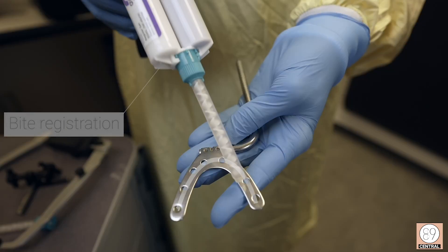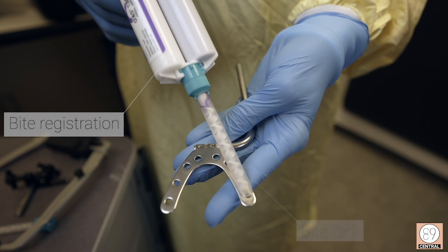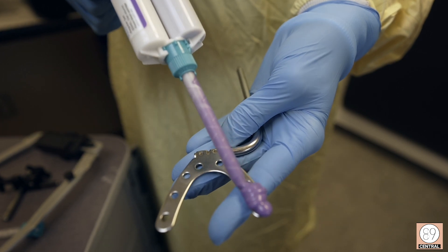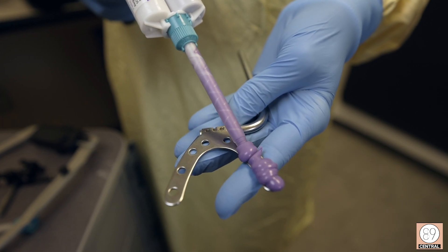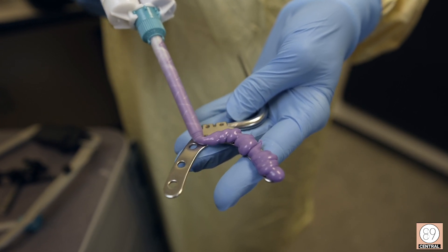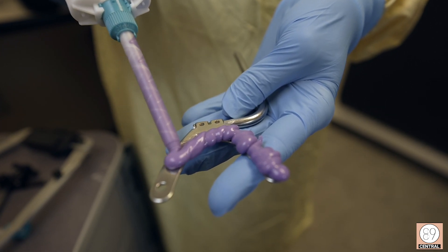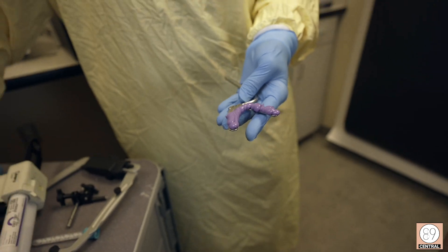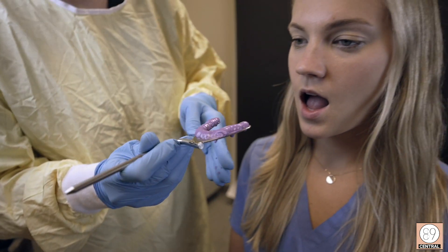You can see these holes in your bite fork — that is where you will apply your bite registration material. Apply the material to your bite fork; you really don't need too much. You can use PVS bite registration material or you can use wax. The problem with the wax is that it can distort with temperature.